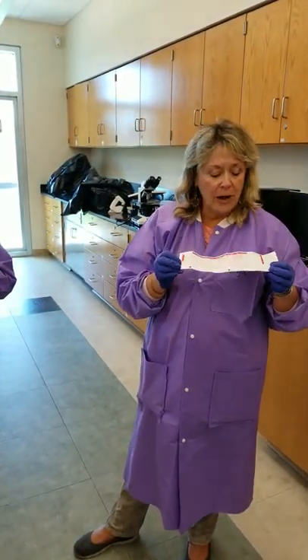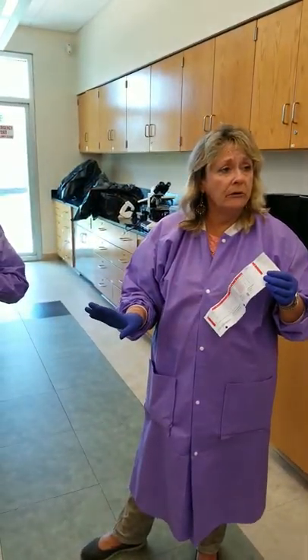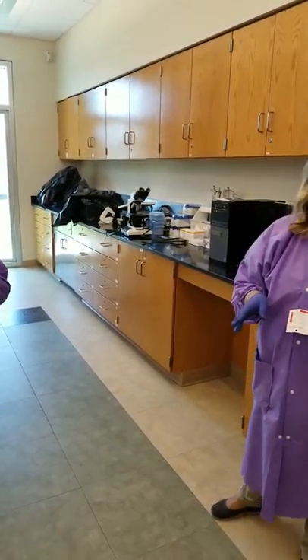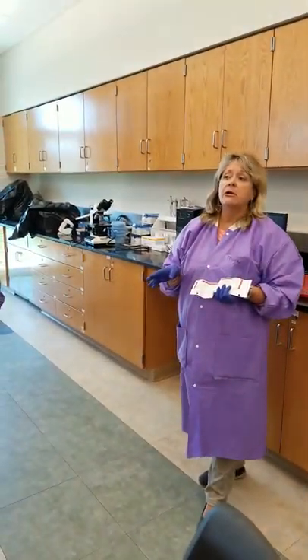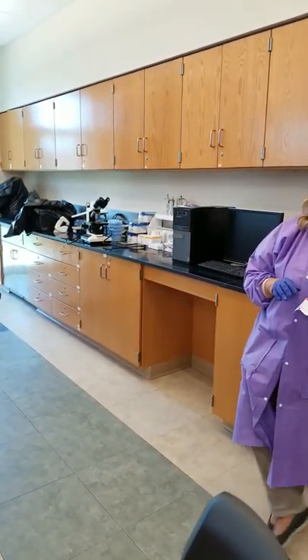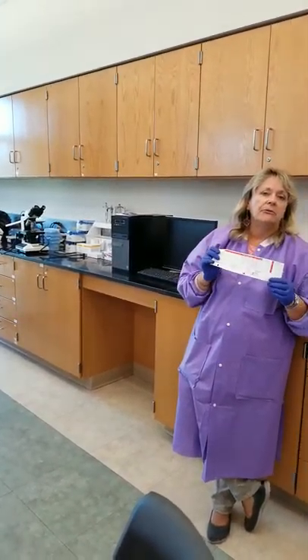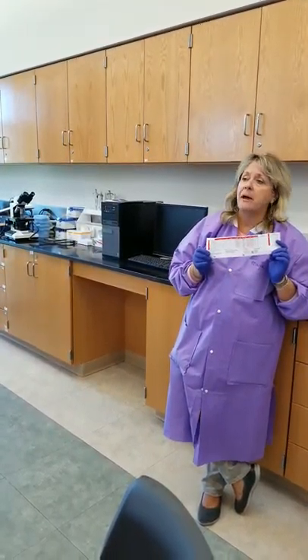So having the right lot number that associates with those screen cells is really, really important, because there's going to be a lot of similarities from lot number to lot number. For instance, typically screen cell 1 is R1R1, screen cell 2 is R2R2, and screen cell 3 is a little r cell, but you may get a manufacturer who wants to mix it up a little bit and be different, and there is one out there. So you want to make sure that what you perceive to be correct is correct if you're dealing with your antibody identification.